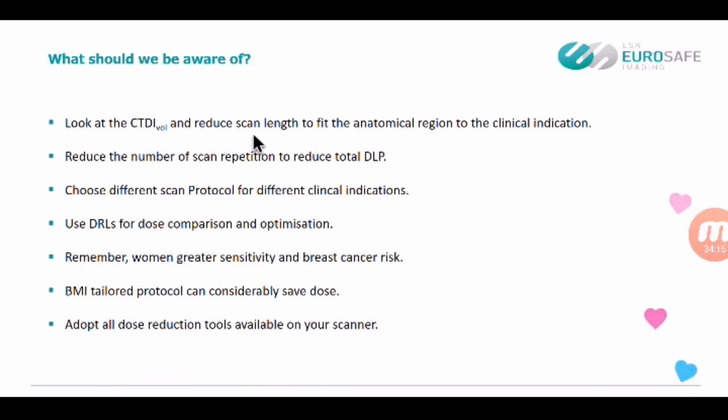Use DRLs for dose comparison and optimization. Remember always that women have greater sensitivity and breast cancer risk is higher. A BMI-tailored protocol can considerably save dose, and adopt all the dose reduction tools available on your scanner.